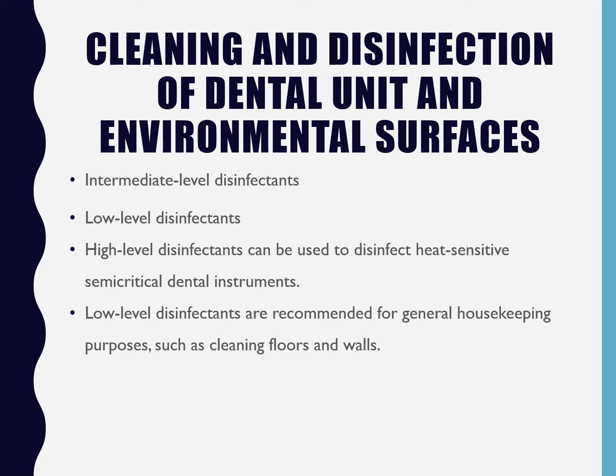So some offices will use this. Sometimes it's referred to as cold sterile. There is more than one type of chemical that can be used in order to sterilize those heat-sensitive things.